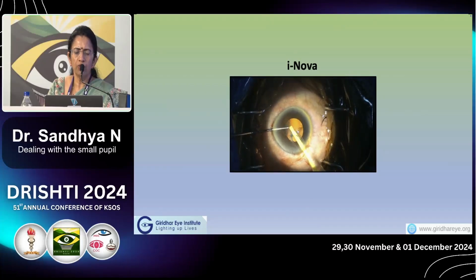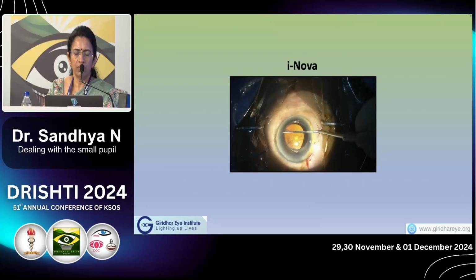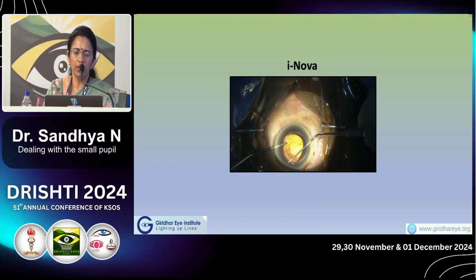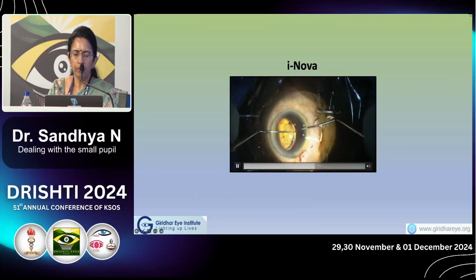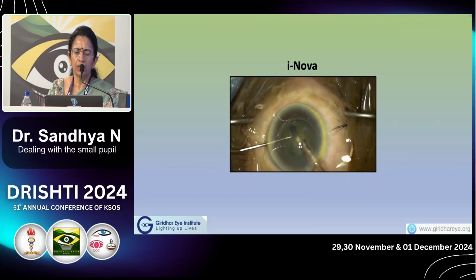When almost 3/4 of the ring is inside the anterior chamber, it can be pulled out, simultaneously withdrawing the injector. So this is a relatively bulky device compared to other devices, but gives a larger pupillary dilatation of around 6.3 millimeter. So then these positioning holes should be carefully engaged at the iris margin using the Sinskey hook. And so you will get a relatively larger rhexis when we are using these.